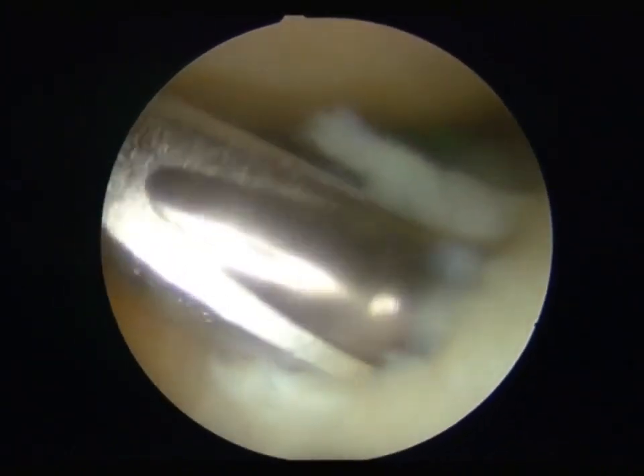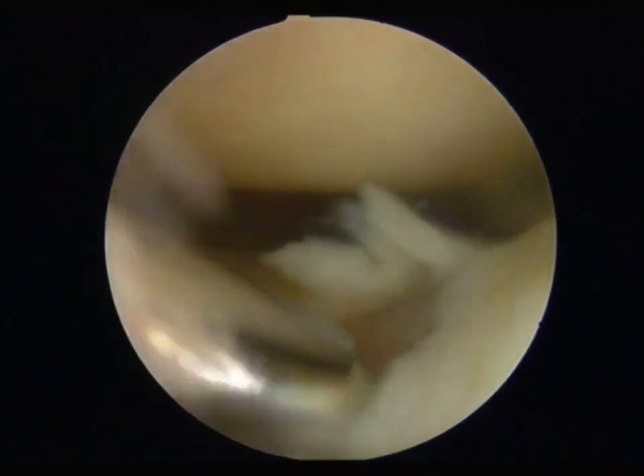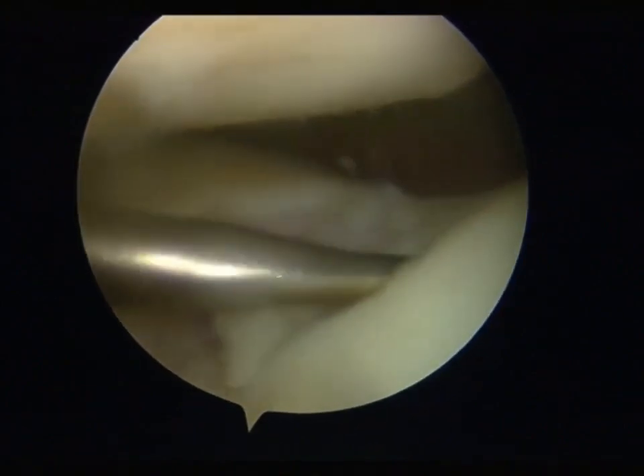Second, use the shaver to scrape off the cartilage on the surface of the damaged joint cartilage. And then, use a scraper to scrape off the unstable cartilage until it reaches the normal cartilage area.